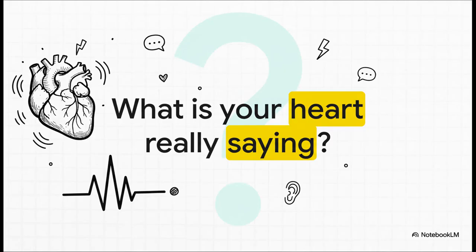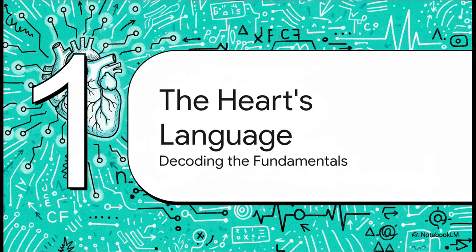So that's the big question, right? When your heart sends out these signals, what is it actually trying to tell us? Well, let's find out together. To understand the story, first, we've got to learn the alphabet. So, in this first section, we're going to cover the absolute fundamentals of the heart's electrical language.